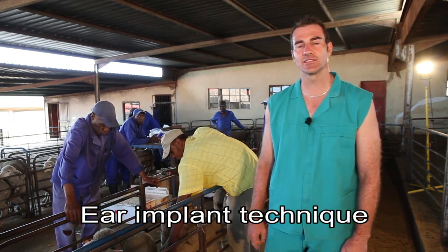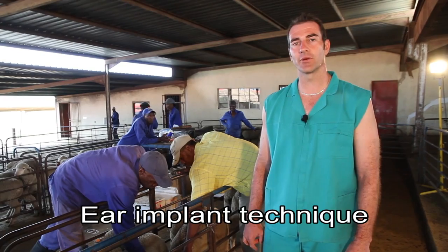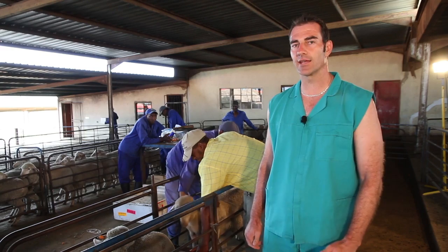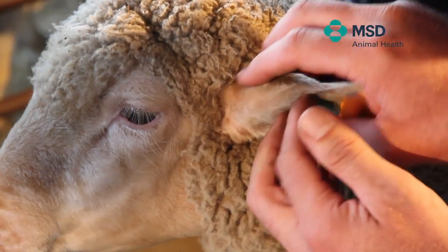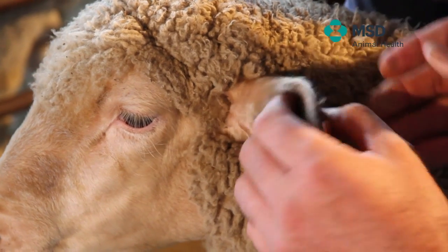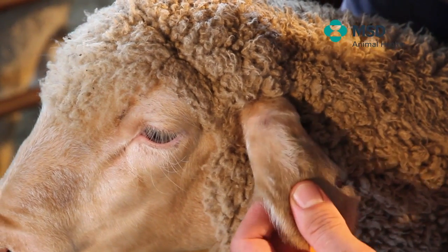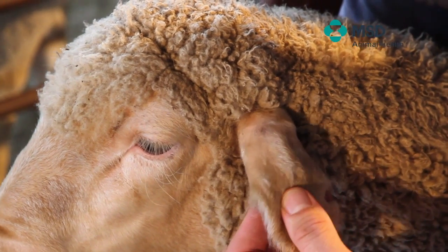The next technique we're going to discuss is the ear implant in sheep. It's very important to make sure that the animal is correctly restrained and cannot move too much, as this will limit injury to the animal as well as the handler. The implant is placed between the two cartilages on the ear on the outside, underneath the skin. Before this is done, make sure that the ear is clean and free of any feces or mud, as we don't want to insert bacteria into the wound.